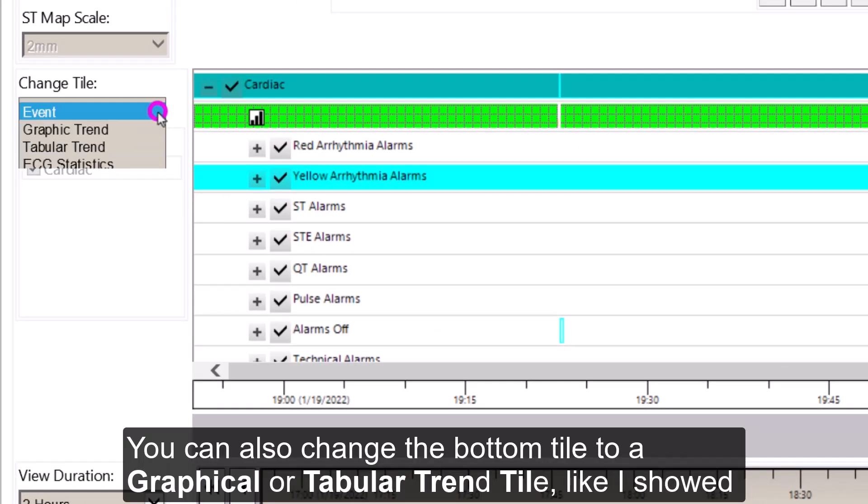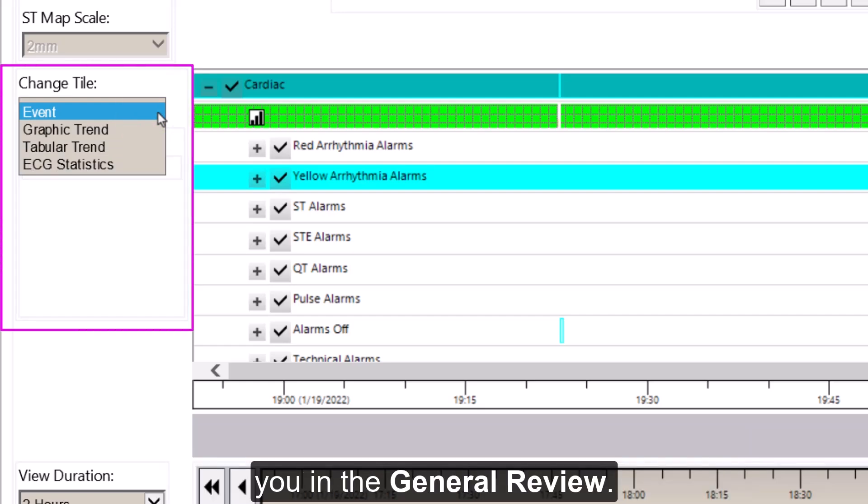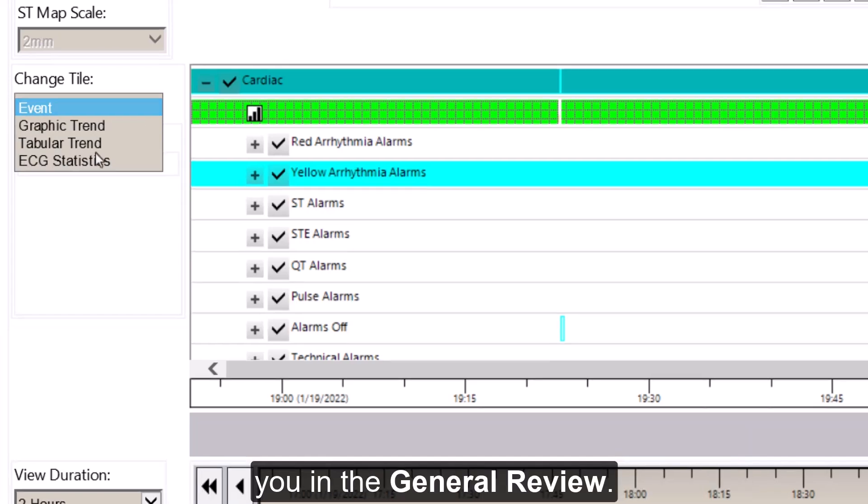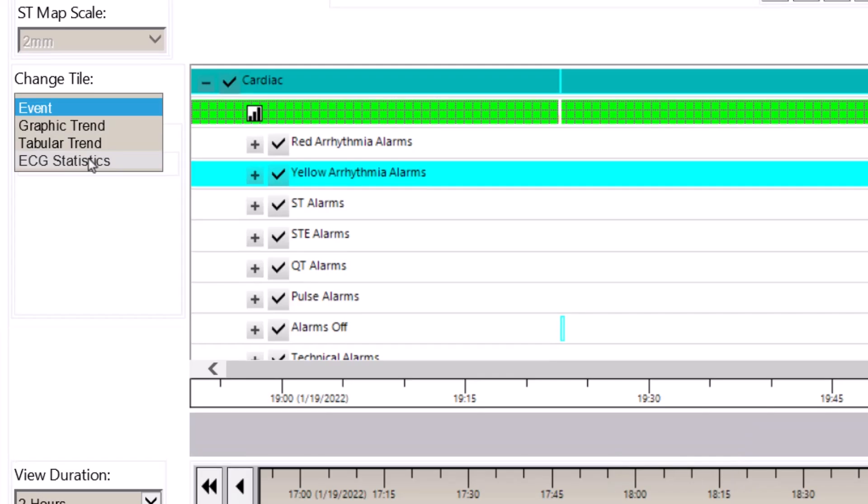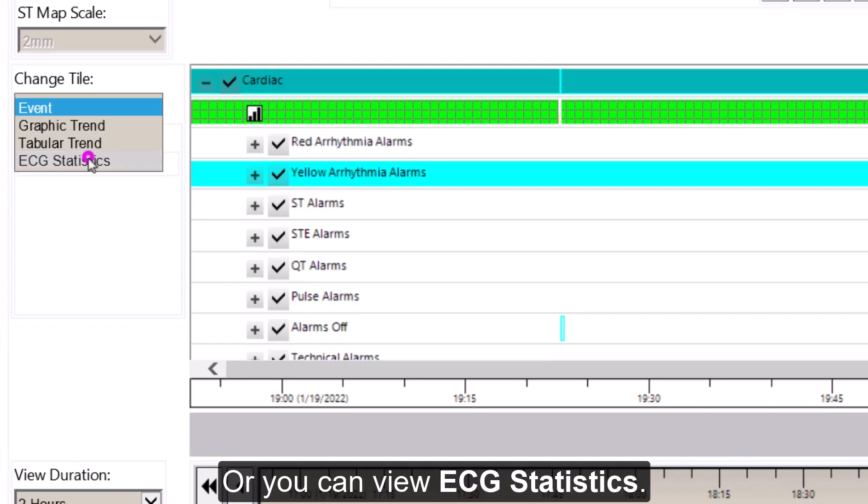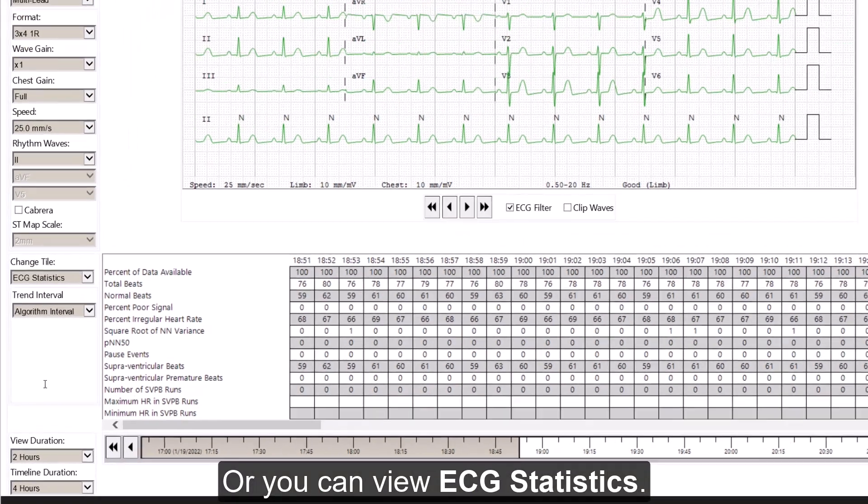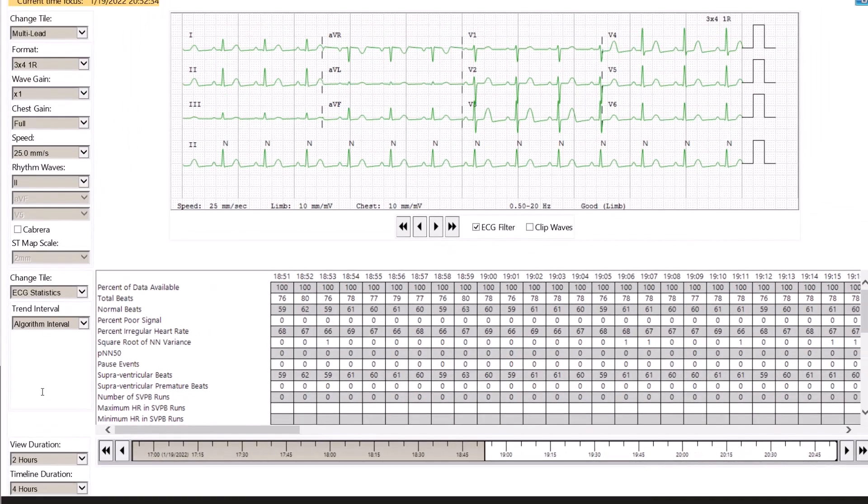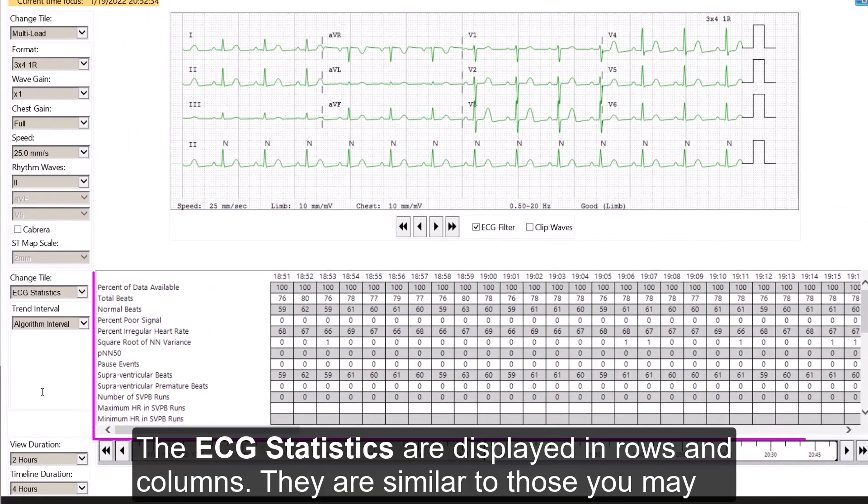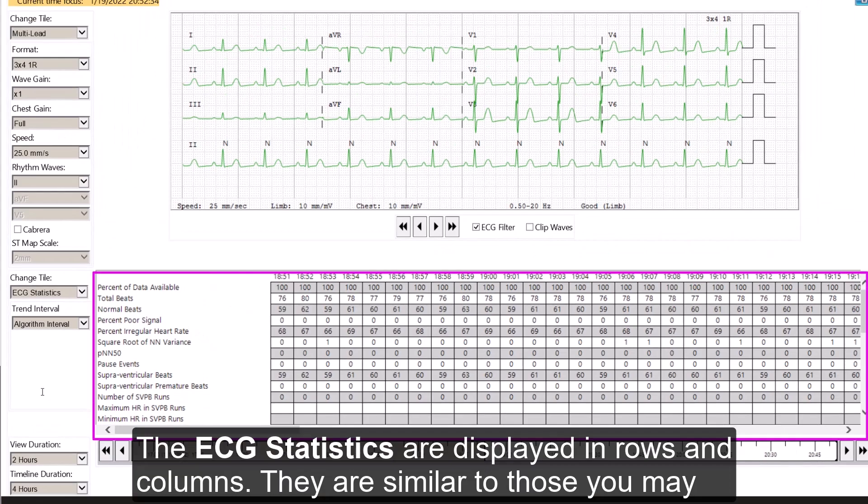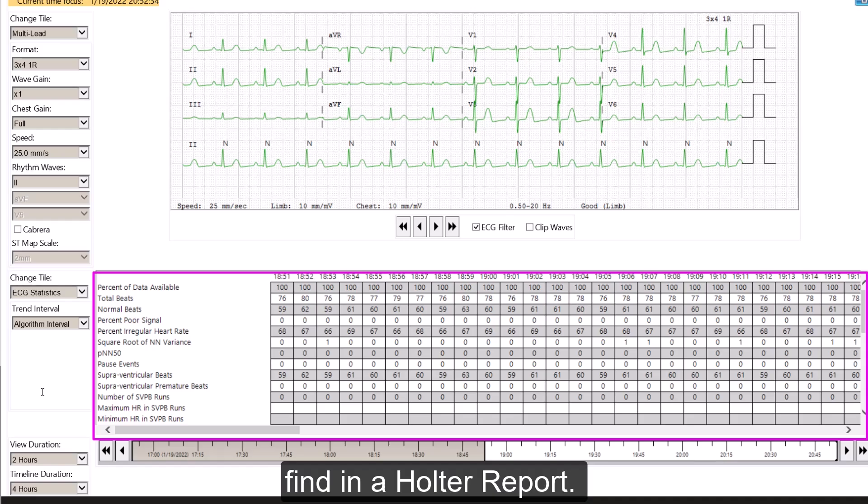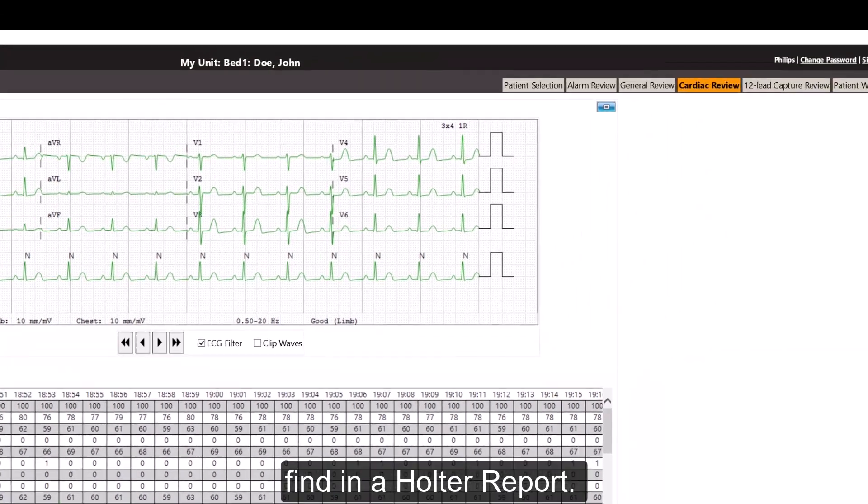You can also change the bottom tile to a graphical or a tabular trend tile, like I showed you in the general review. Or you can view ECG statistics. The ECG statistics are displayed in rows and columns. They are similar to those that you may find in a Holter report.